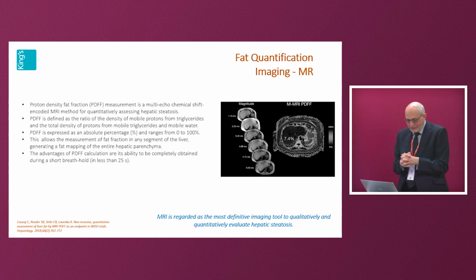But where this is useful is that it is accurate, and it's been accurately matched up to a liver biopsy and shown to be very good for it. And we use it now as a tool in commercial studies or research studies where there's follow-up of fatty change. And this will become your reference standard for hepatic steatosis. But let's have a look at ultrasound and see how it goes.